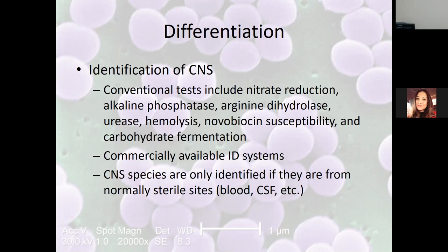And the old, I'll say, we used to teach this with test tubes. We would put the chemical reaction in the test tubes, and you'd see the color change, and then you added your sample and incubated them overnight. So we've gone high tech today. We have a little test strip that has about 20 wells going across it. You're going to make up a suspension first of your organism, and then you're going to load your wells with that organism, okay? There are going to be some things in those wells for the organism to grow and react with and change colors, depending on what the organism is producing, okay? And then come back Thursday, we'll read those results and key them in and get our identification done. And we did it, right? That's the goal of the week.